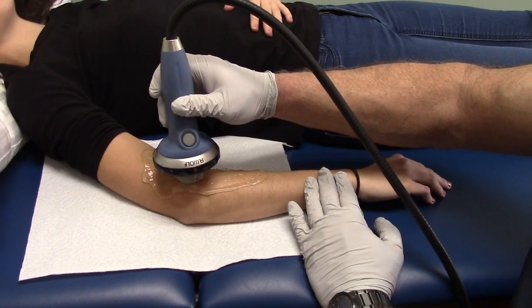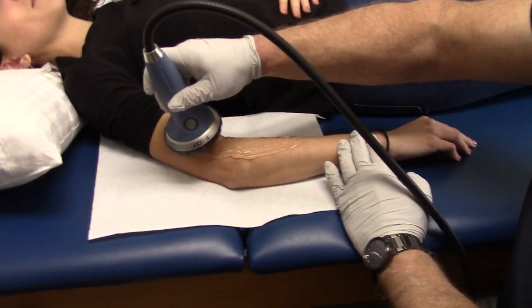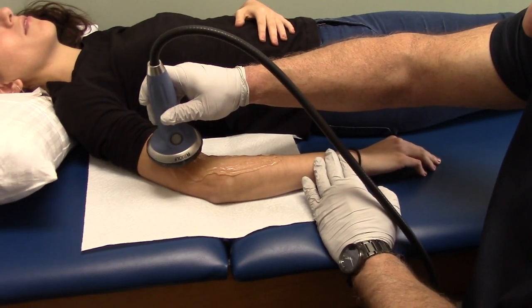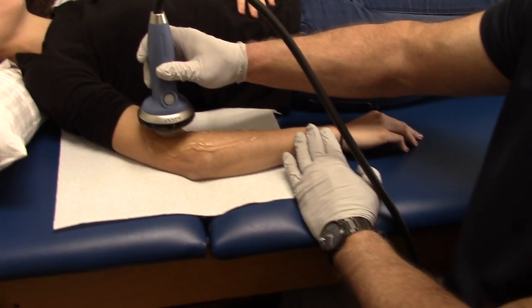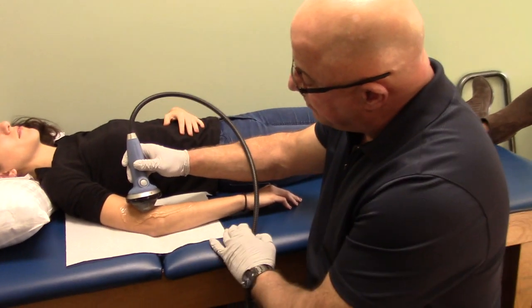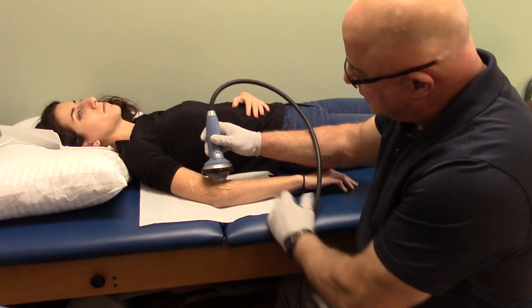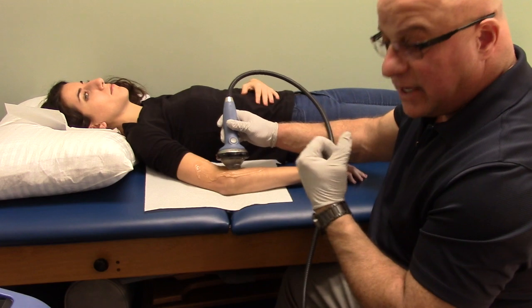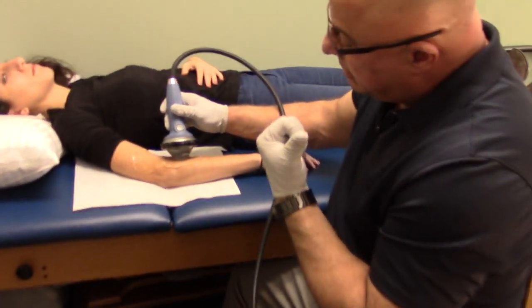One of the things about scar tissue and adhesions — let's explain that a little bit. Adhesions and fibrosis: think about the analogy of a cobweb that forms within the muscle. Scar tissue — you can use the analogy of rust that forms on a surface or around the joint area. As we're utilizing this, it's kind of like sandblasting a surface — it breaks up all that scar tissue.